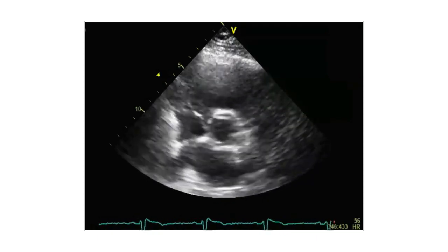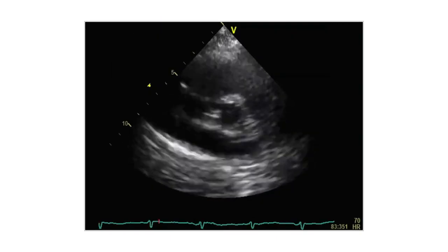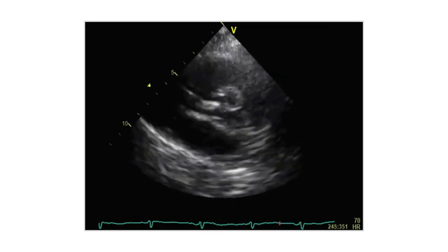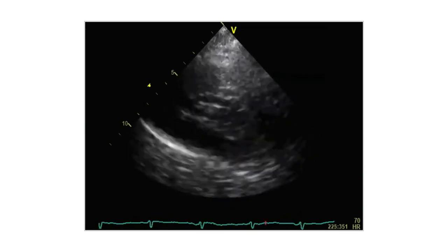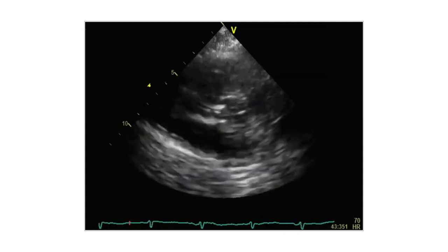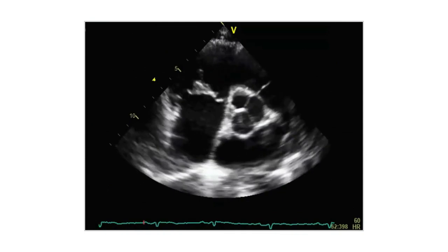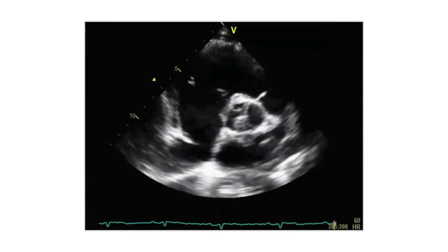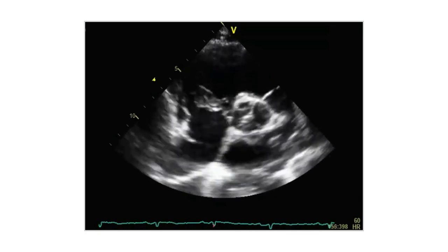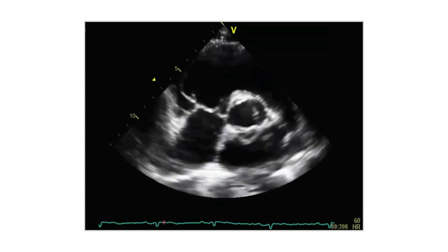And make your choice in the meantime. Here's the third example with again aortic valve, not really easy to say out of this example, and the last one. So this is the fourth and last example. Did you recognize the aortic stenosis?